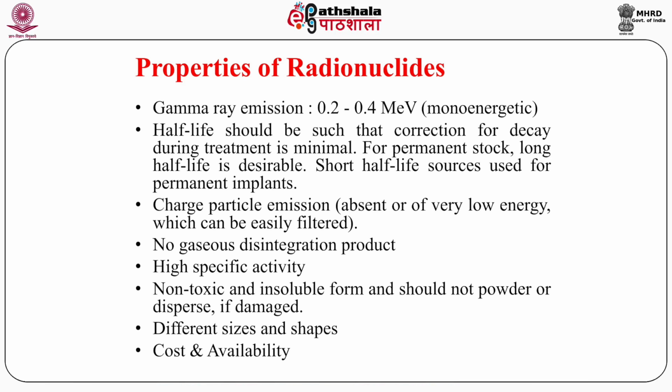Different sizes and shapes. The sources which are used can be made of different sizes and different shapes. Cost and availability. The material which is used for brachytherapy should not be very costly, and should be easily available so that its use is viable and convenient.